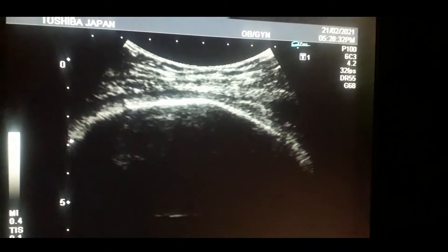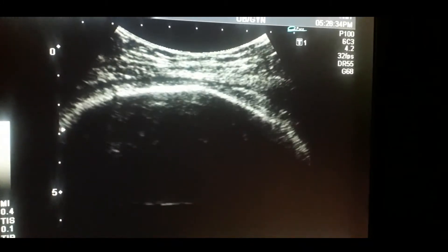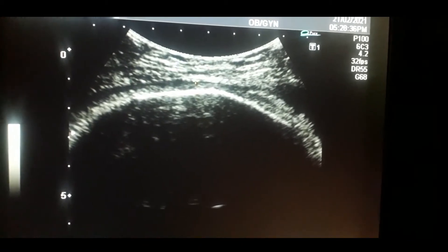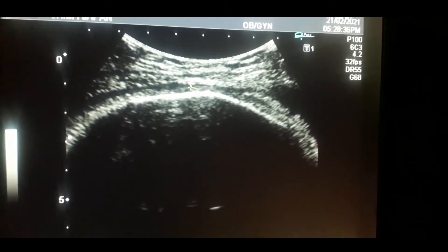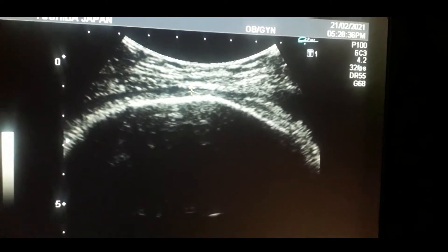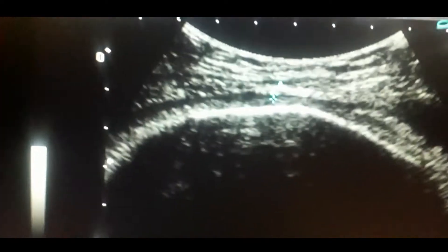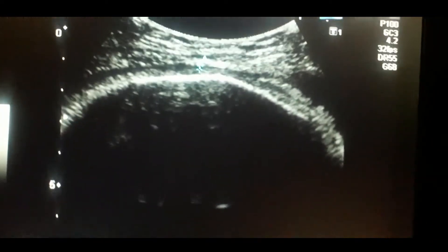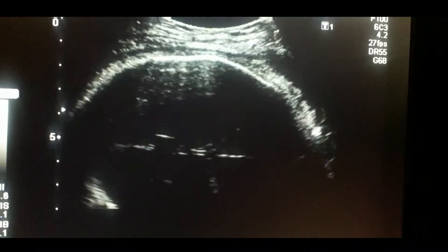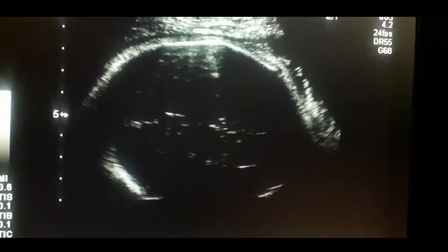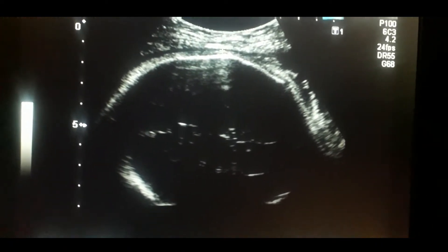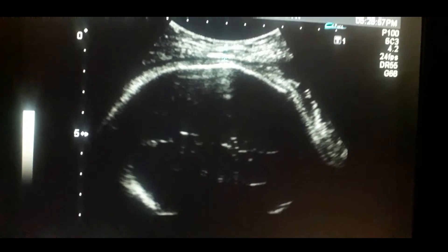This is a cephalic fetus and we have to calculate the distance between the skull and the abdominal wall. I have calculated the scar — it is quite thin, roughly 1.5 to 1.6 millimeters thickness. Normal scar thickness should be more than 3 millimeters.